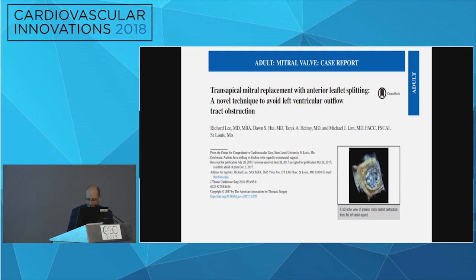One more question. Yes, ma'am. Just think of the concept: with LAMPOON, you're completely lacerating the leaflet. Correct. In this case, you're ballooning, you're in the middle, and now you're tenting it up with this valve. So you might actually pull up the subvalvular apparatus, like the muscles. Would that change the configuration below?